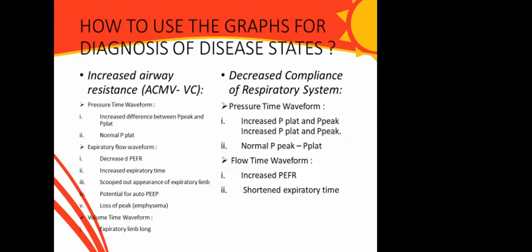So how do you use these graphs to diagnose your disease state, especially during ventilation? These are some of the things we've mentioned before, just with some additions.